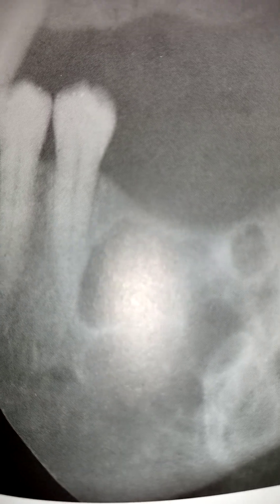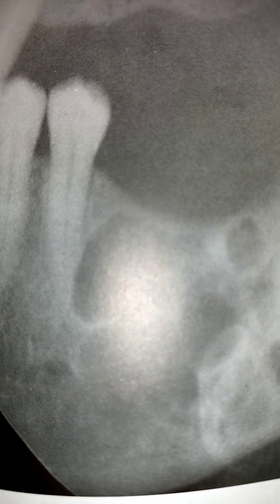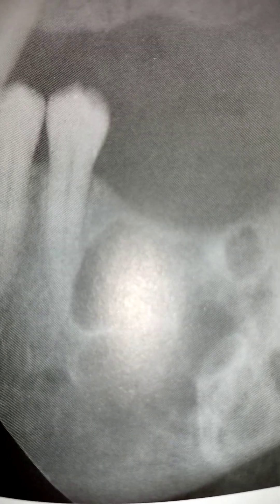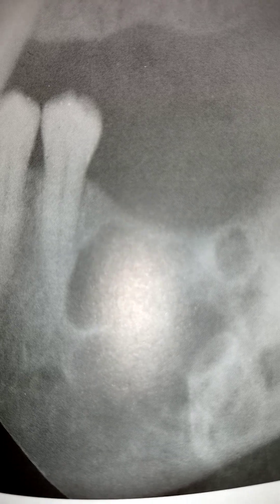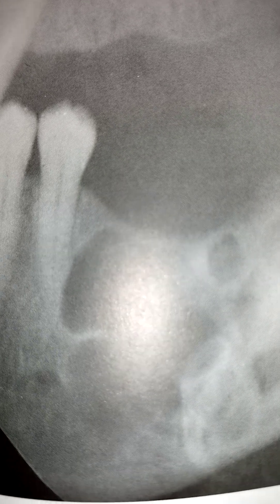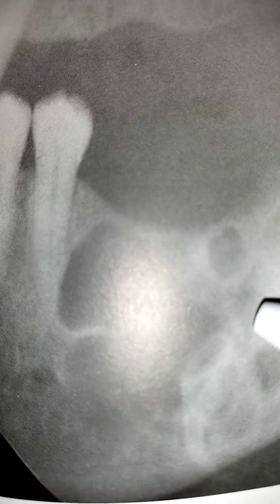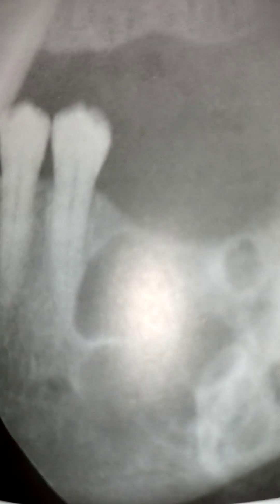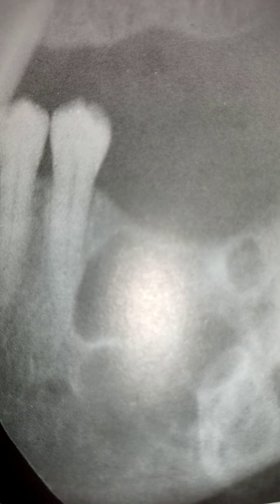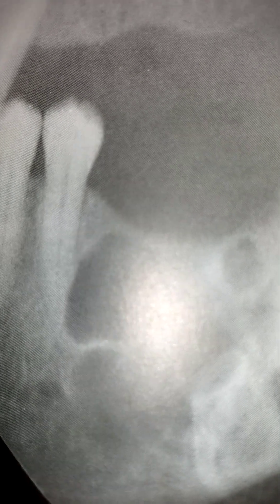This is a radiograph of an odontogenic keratocyst with multiple locules, as we can see here clearly. Thank you for listening and goodbye for now.